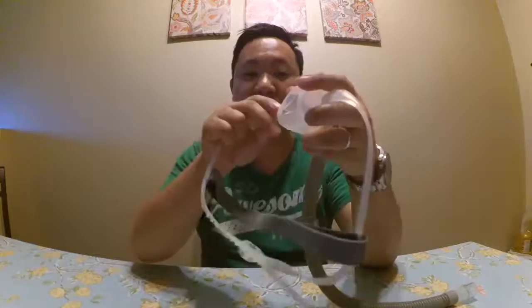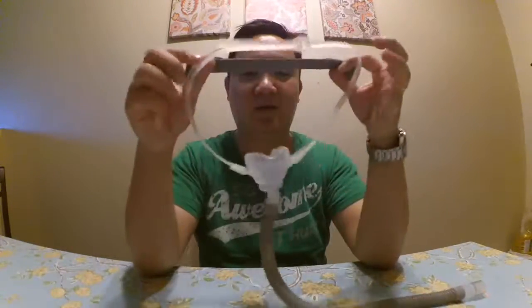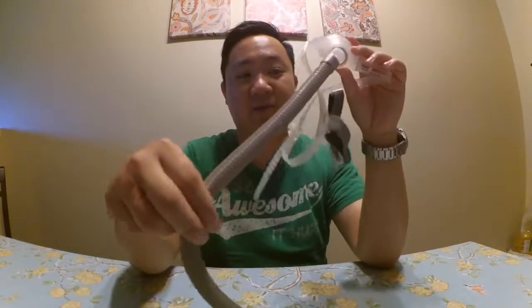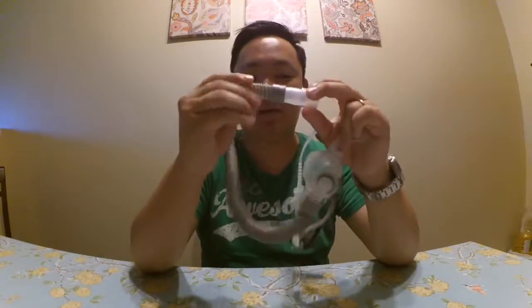After washing it and drying it, just put it back on, put the headgear back on, and you're done — good to go. Another thing I like about this is that it swivels, so anywhere I go in bed it comes with me. If I pull it this way it just goes along.